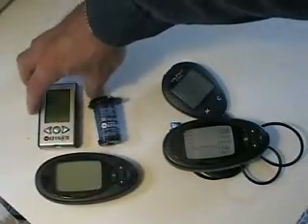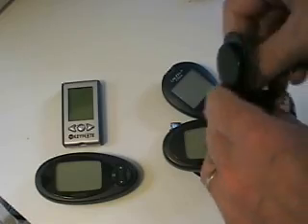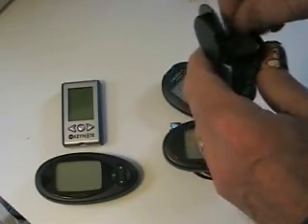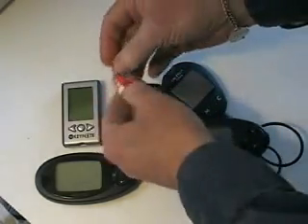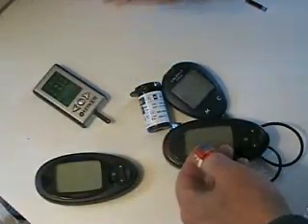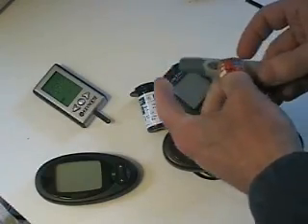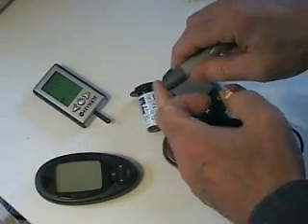So now let's go and calibrate against the very nice and very accurate WaveSense Keynote meter. I like the design of the test strips on this. I also like their cost — in this case I'm paying for the strips myself and I was able to buy a box of 50 for about $20.